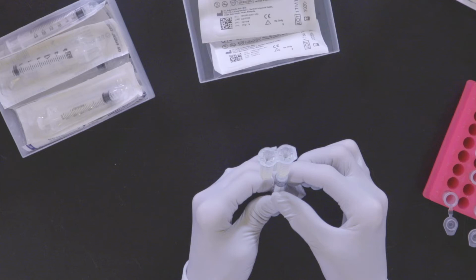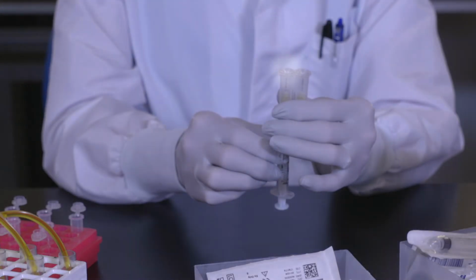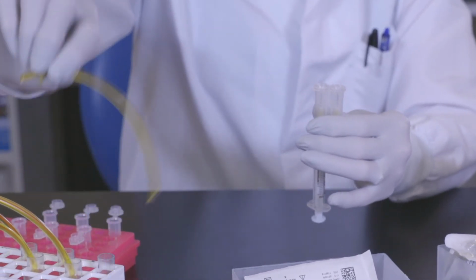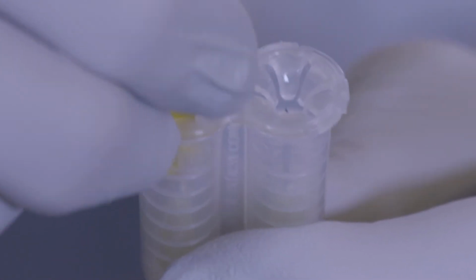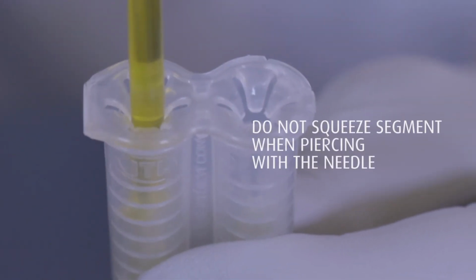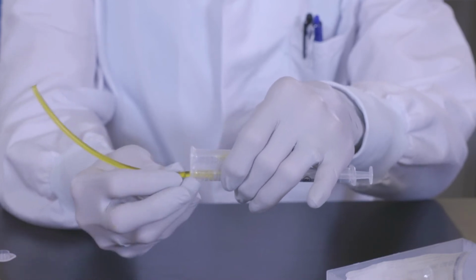Next, hold the assembled segment sampler and syringe in one hand. While observing the segment sampler opening located on the same side as the attached syringe, hold the tubing segment with the other hand. Now, insert end of tubing segment straight down into the segment sampler so that the segment is pierced by the internal needle. To avoid potential sample exposure, do not squeeze the segment during this step. It may be helpful to hold the segment sampler horizontally to observe the piercing of the segment end.